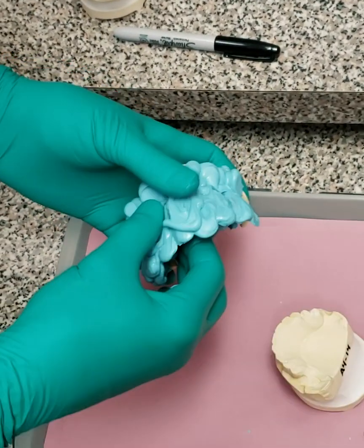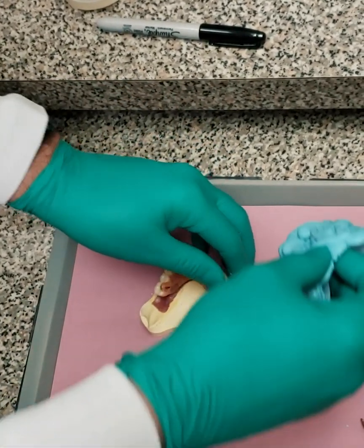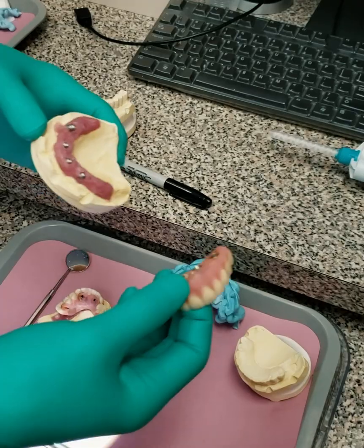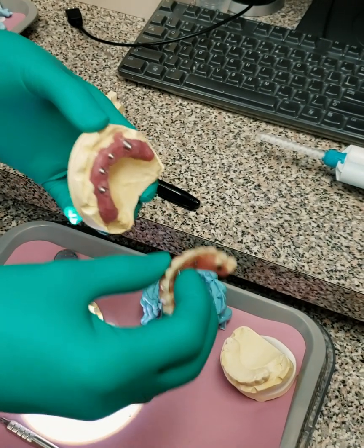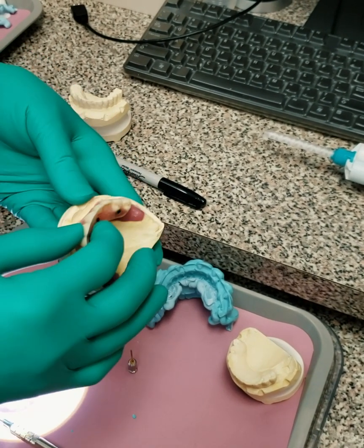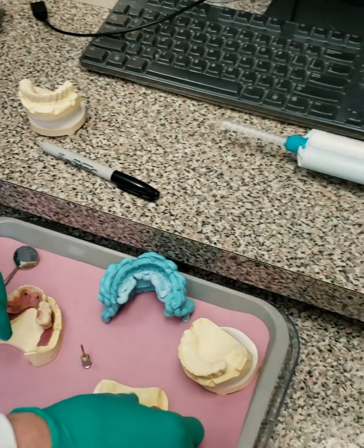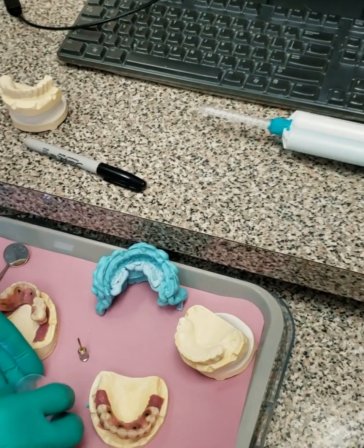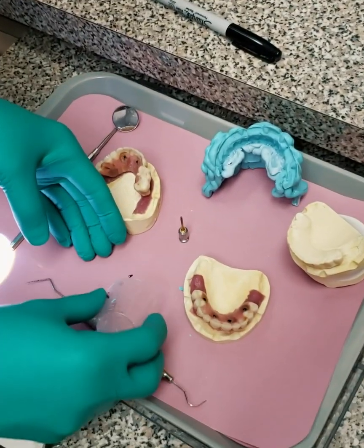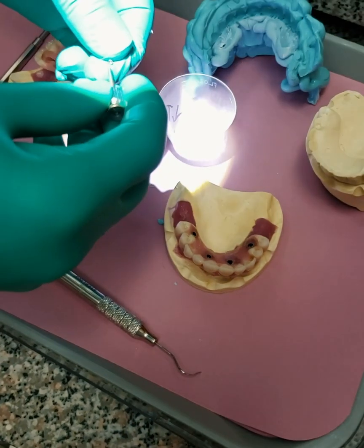Now, since we're doing a double, what we do is remove the maxillary transitional from the mouth. Since this is a double, we now add the upper provisional to the upper study model. Take the screws and apply the screws.